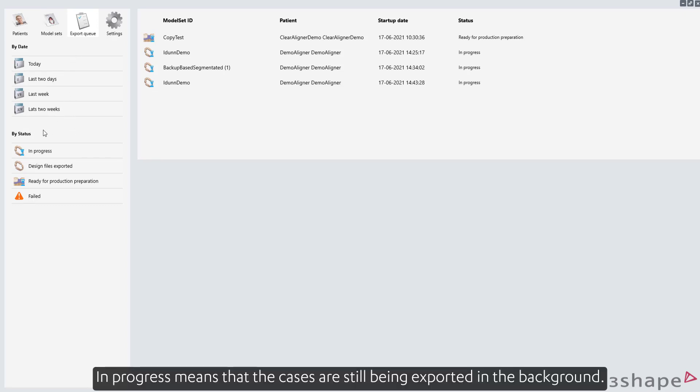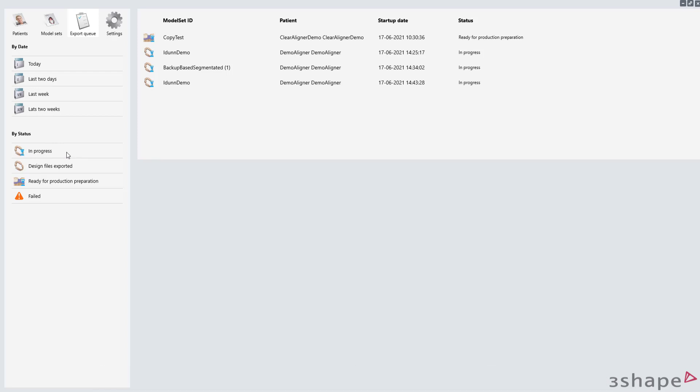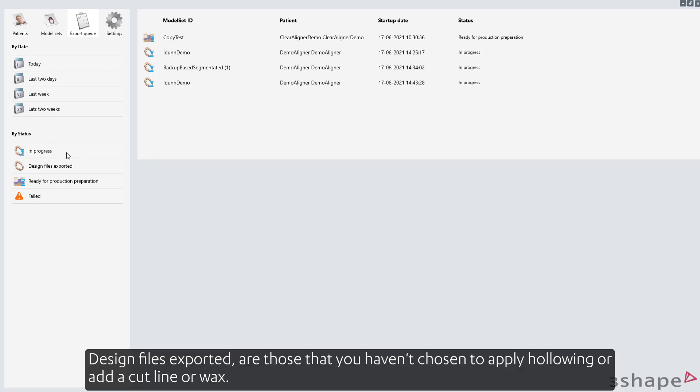In progress means that the cases are still being exported in the background. Design files exported are those that you haven't chosen to apply hollowing or add a cut line or wax.